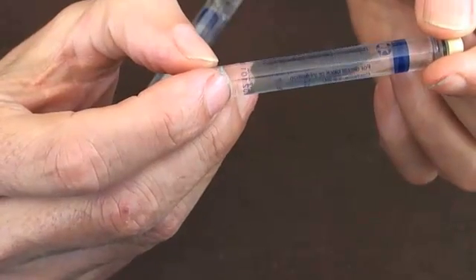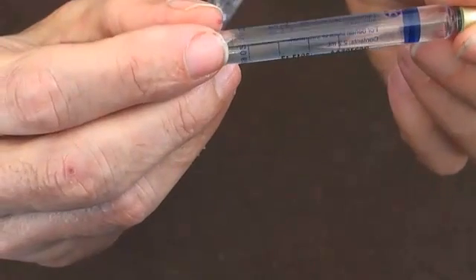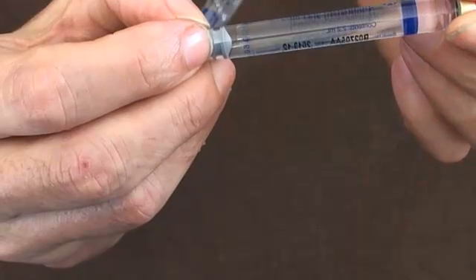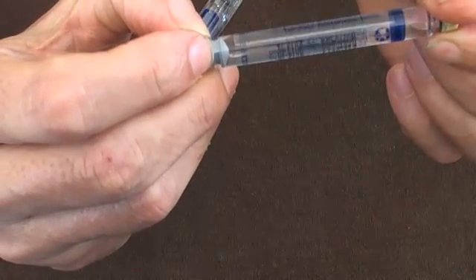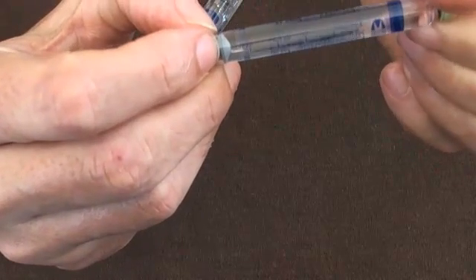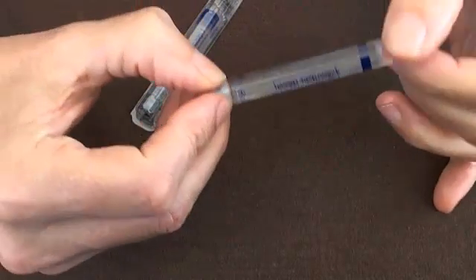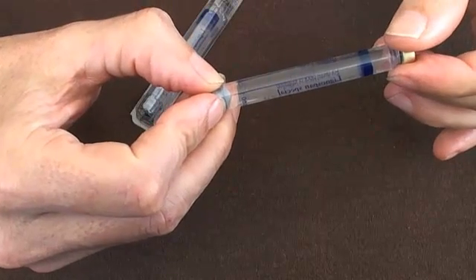The other element you'll see is fine print on these carpules — it's probably too fine to pick up on camera. In the smaller print below the name you can actually see what sort of vasoconstrictor the solution also contains, because most local anaesthetics come with some sort of vasoconstrictor.